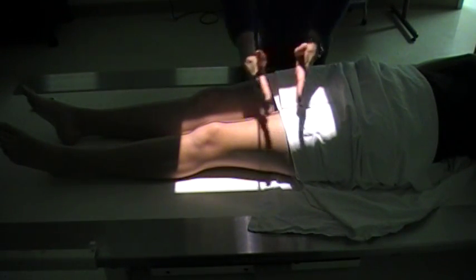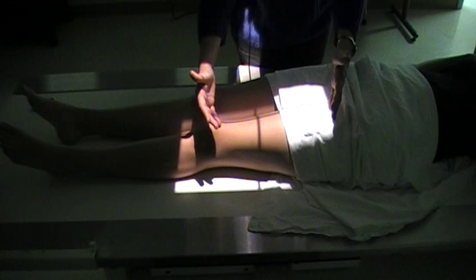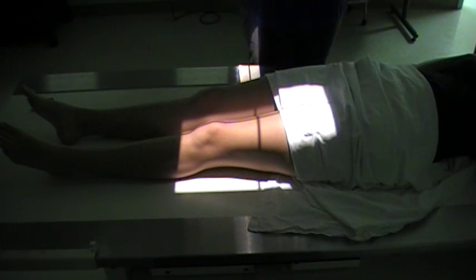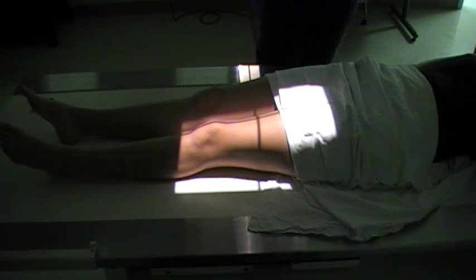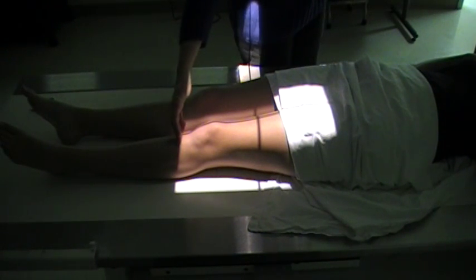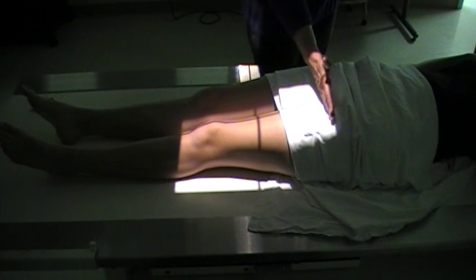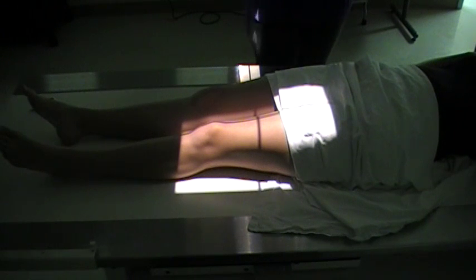I'm going to use the length of the cassette to get the majority of the femur as well as the knee joint, because we're pretending her injury is in the distal knee. So you have the light about 2 inches beyond the knee joint, and then where the light field ends, we will get on our second image, which will be a 10 by 12 to include the proximal femur and the hip joint. Just keep in mind, whenever you're dealing with long bones, you want to include both joints.